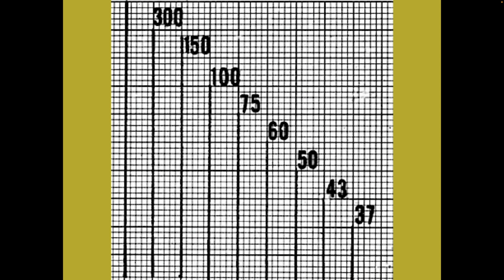Do you have a way to remember the numbers, or you just say it? You know, if you do it 5 times, you'll get it. So the only other way to do it is to calculate it: if I'm talking about 0.2 seconds, how many increments of 0.2 seconds are in a minute? And that's 300. That's a lot of math. Right, and that's why it's easier to just memorize it. People pick it up really fast.